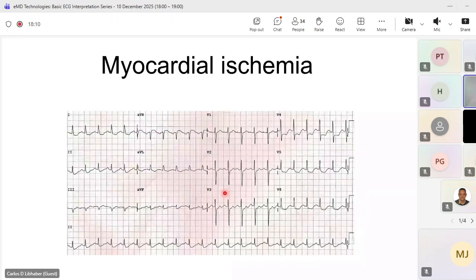Here you have a patient, you put him on the treadmill, and suddenly you have the ST with the J point down. You see, it's not on the isoelectric line, it's down at least a millimeter, and it takes more than 2 millimeters to go back to normal. Through here, through here. Here I wouldn't say, but here definitely.